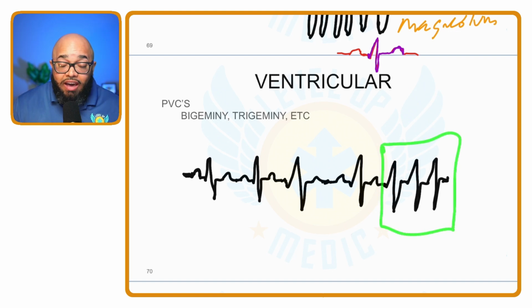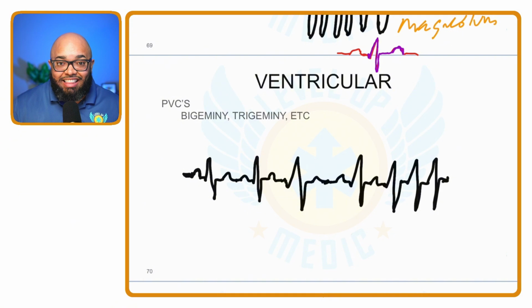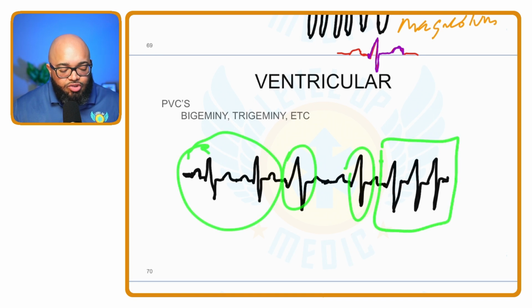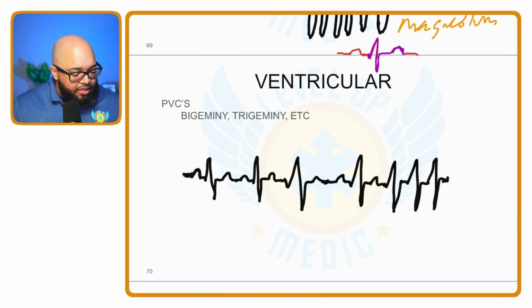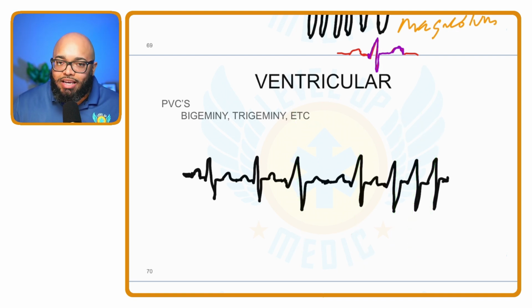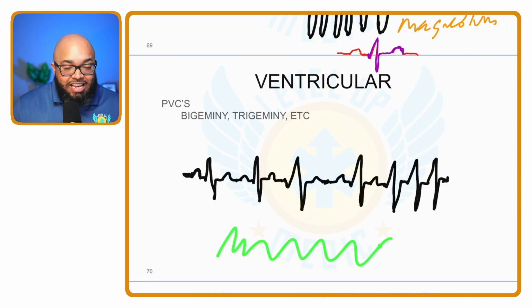This can be very fatal because of what can happen next. They start off in a normal beat, but then they had a PVC and maybe they had another one, but then they went into this run of VTAC. Well, these extra beats were not producing a normal beat, so it was interfering with cardiac output. It's interfering with blood flow.